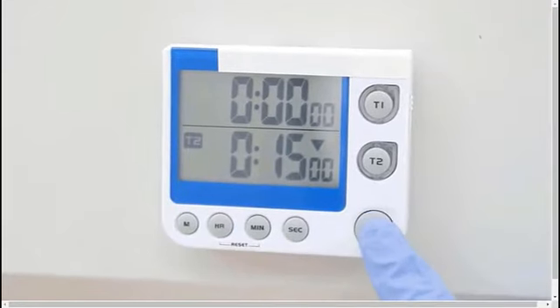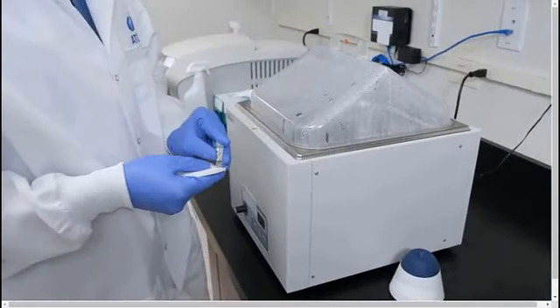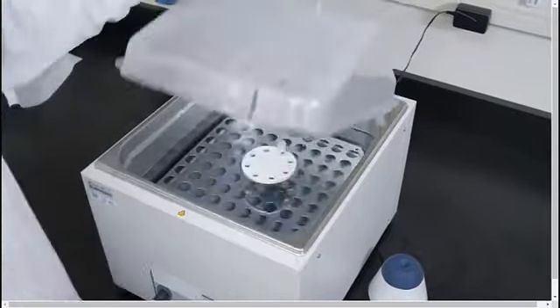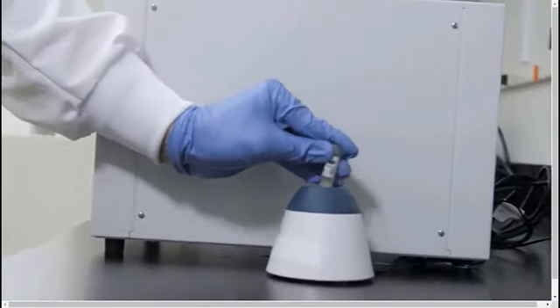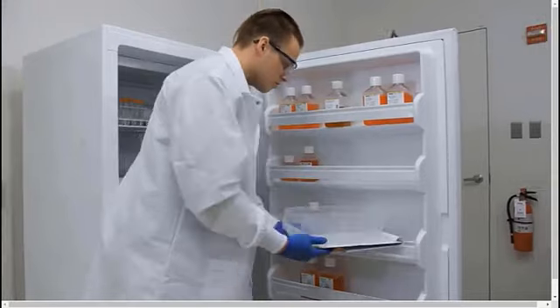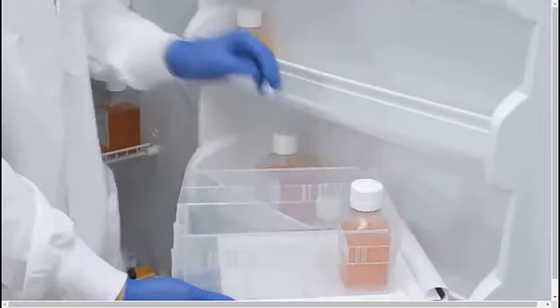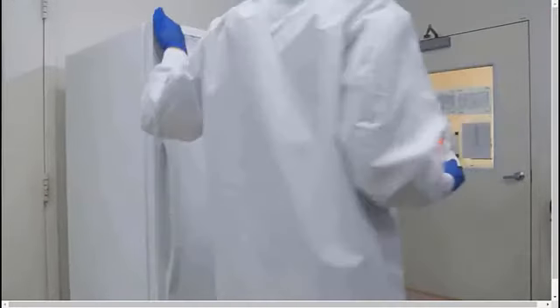Let the vials incubate for 15 minutes at room temperature. Some components may be difficult to reconstitute. To help the material enter solution, incubate the vial in a 37 degrees centigrade water bath for 10 to 15 minutes and then briefly vortex. Depending on the media formulation, additional components may be required, such as conditioned media derived from specific cell lines designed to overexpress organoid culture relevant growth factors.